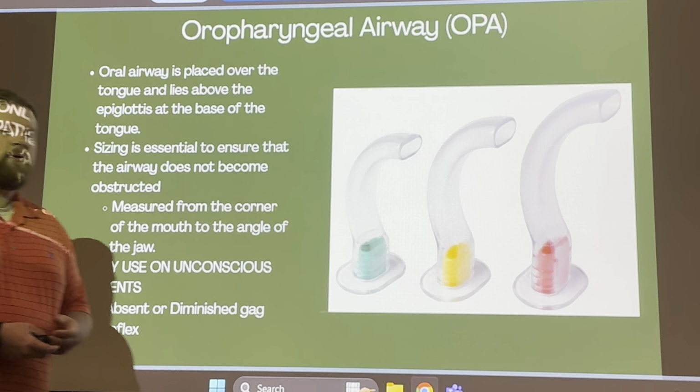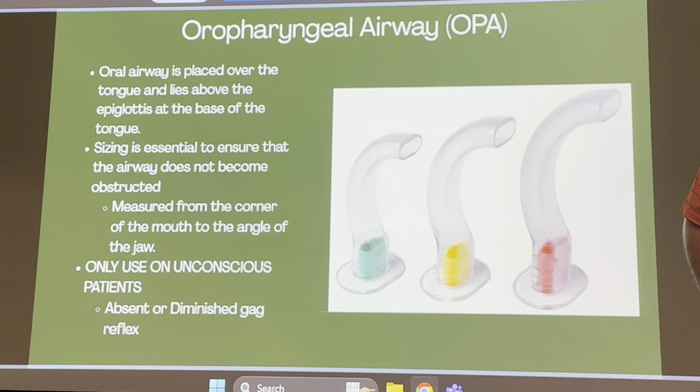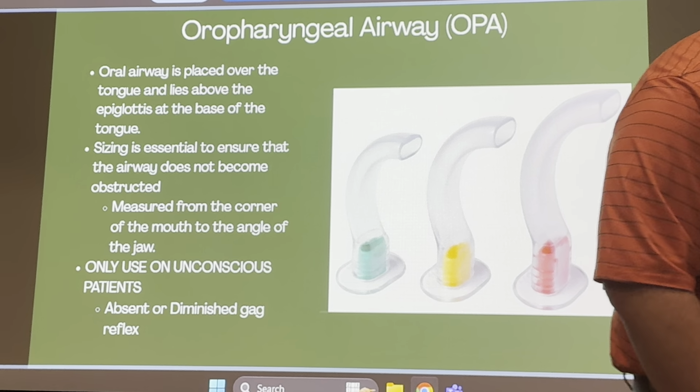So we have what's called an OPA, or an oropharyngeal airway. And let's see, where'd it go?